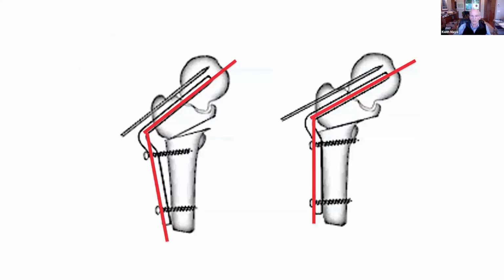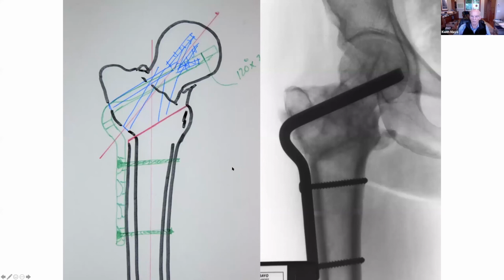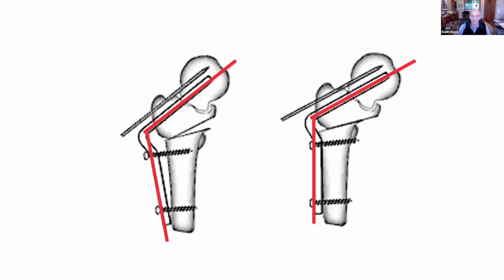If you have a very long blade, an 80 millimeter blade, and you have a lot of displacement, let's go back here. You have a lot of displacement here, and you have really good bone. As you pull this in, two things can happen. One is you're going to lateralize the shaft, so you haven't planned very well about how far you're going to seat this. And secondarily, what you can end up doing is actually the plate will bend and you'll lose correction in the frontal plane. That only happens in situations in which you have a tremendous advantage mechanically with this proximal screw and good bone.